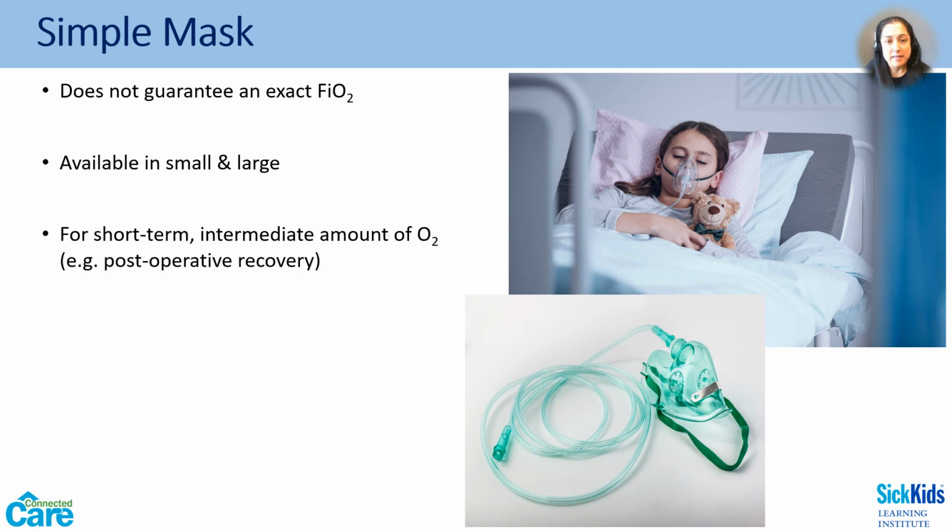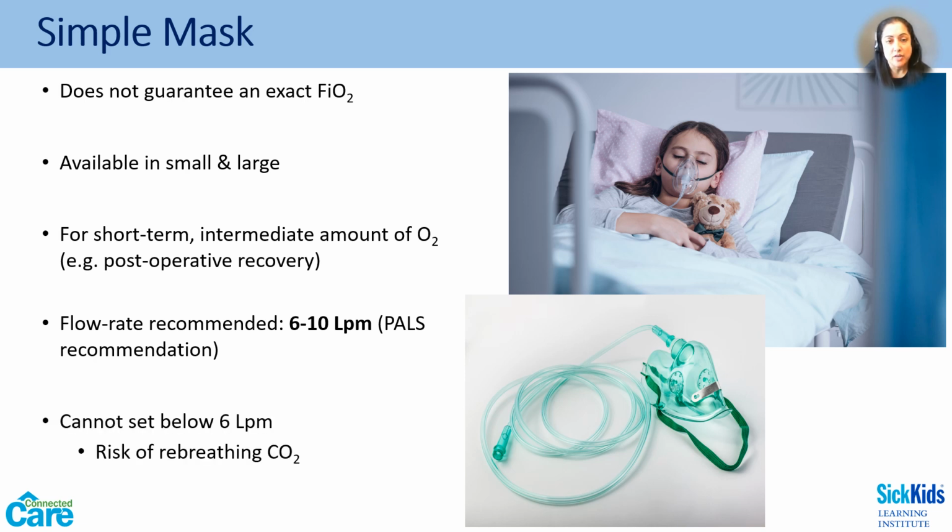And the simple mask is typically used for short-term events like post-OR recovery. And the simple mask must be set to about 6 liters per minute or above. And this is based on the most recent PALS guidelines. It can provide an FiO2 in the range of about 0.6 to 0.4.